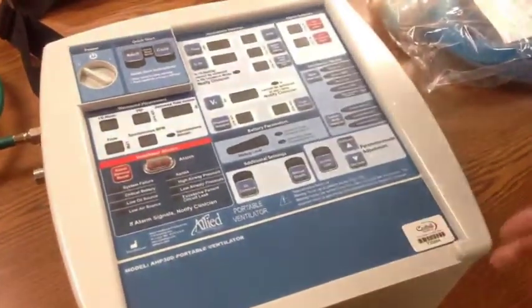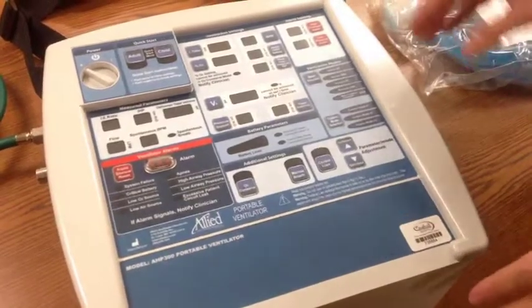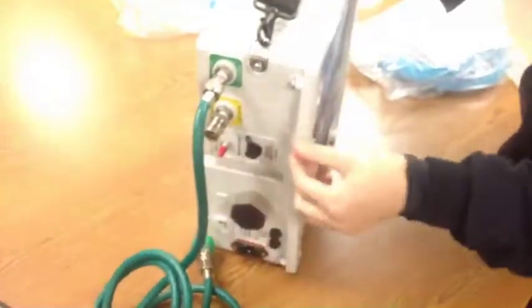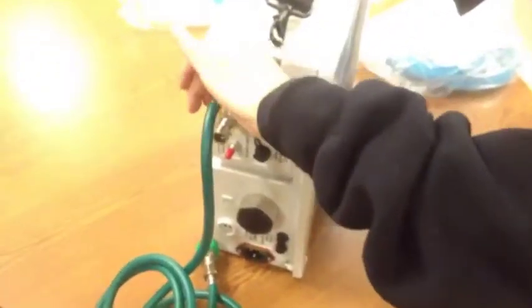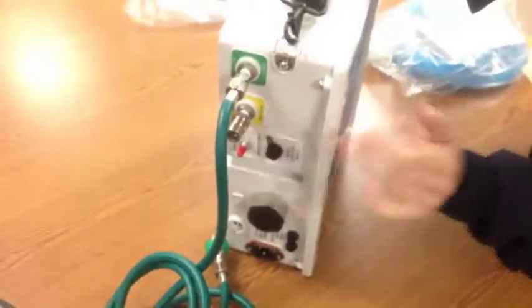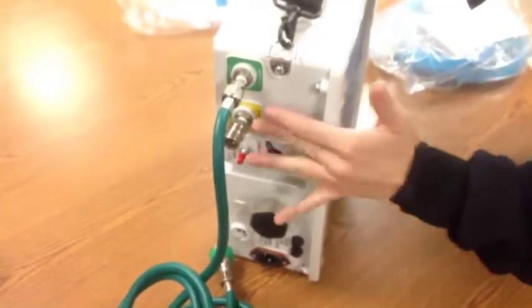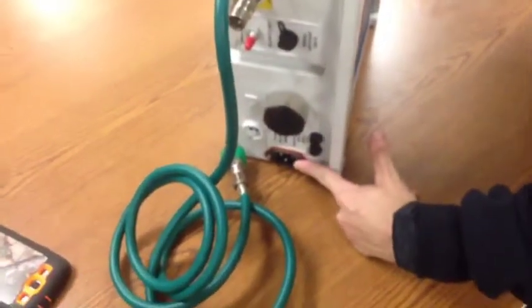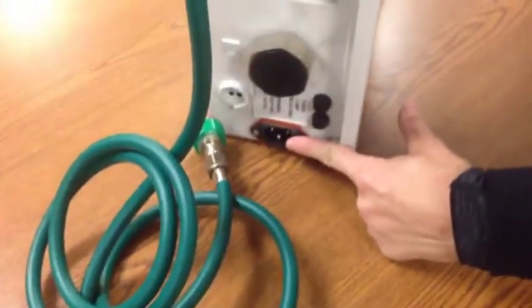For our next demonstration, this is our Allied portable ventilator. It is completely portable. Using a strap, you can carry it or attach it to a stretcher. When using any vent, one of the most important things to do, when you have your oxygen tubing, your oxygen supply attached, is to make sure that fitting is nice and tight. This one also has the option of running medical grade air through it. And one of the other important features down here is the AC power outlet adapter.